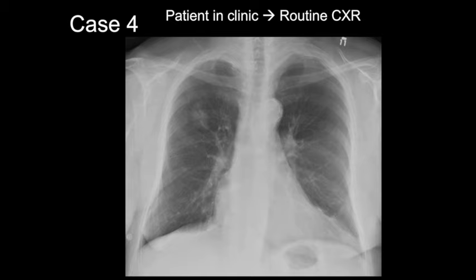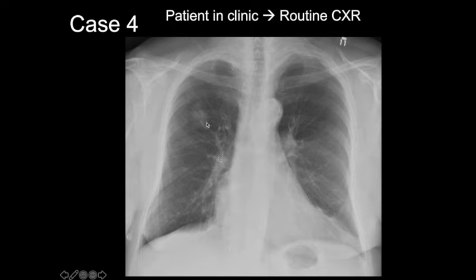Next case. Going through our approach — heart, mediastinum, comparing both lungs, zigzagging up both lungs for subtle findings. No pleural effusion or pneumothorax. Soft tissues, bones, and abdomen are okay. Checkpoints: maybe some scarring in the apices, hyla okay, nothing behind the heart or diaphragms. You probably noticed this nodular abnormality in the right upper lung. This contrasts with our previous cases of consolidation, interstitial edema, and pulmonary fibrosis — now we're showing a pulmonary nodule.